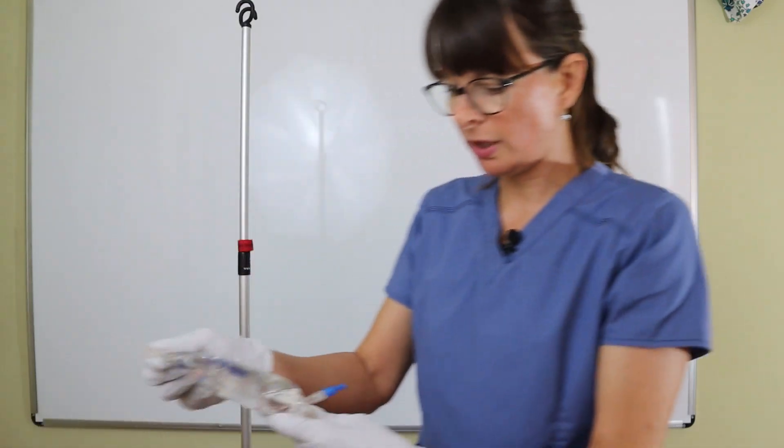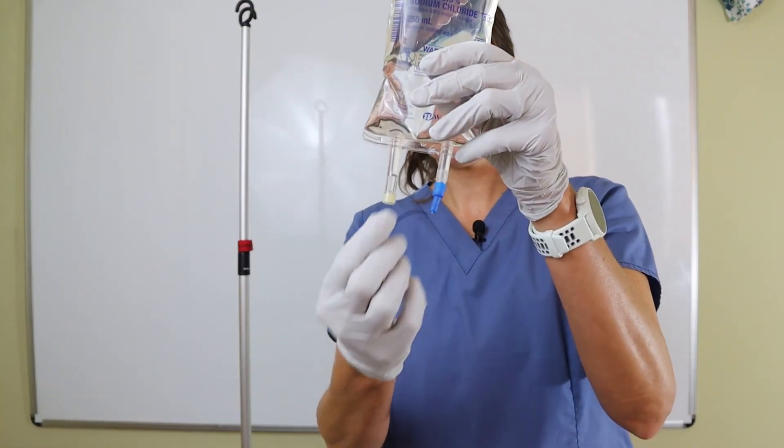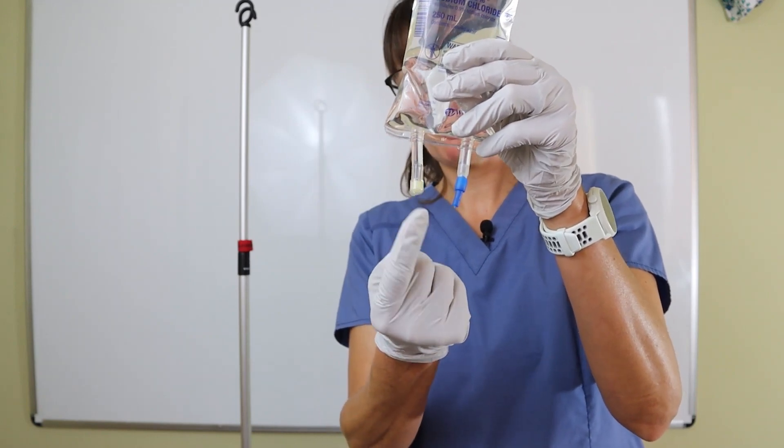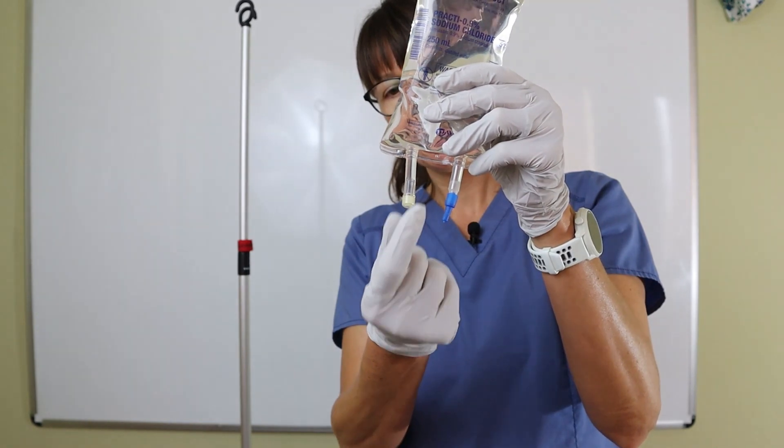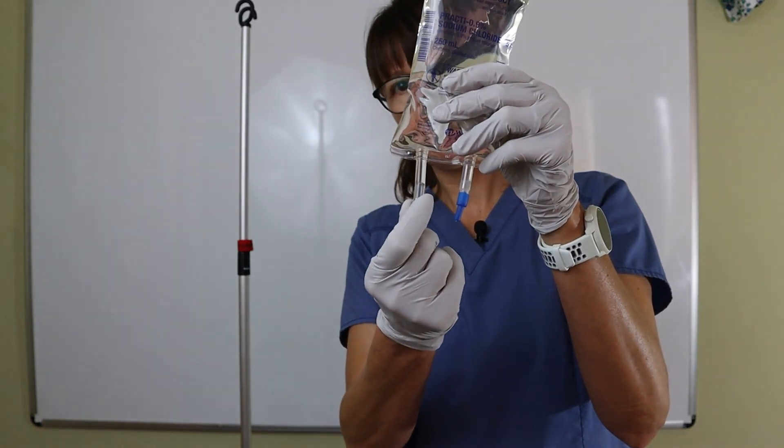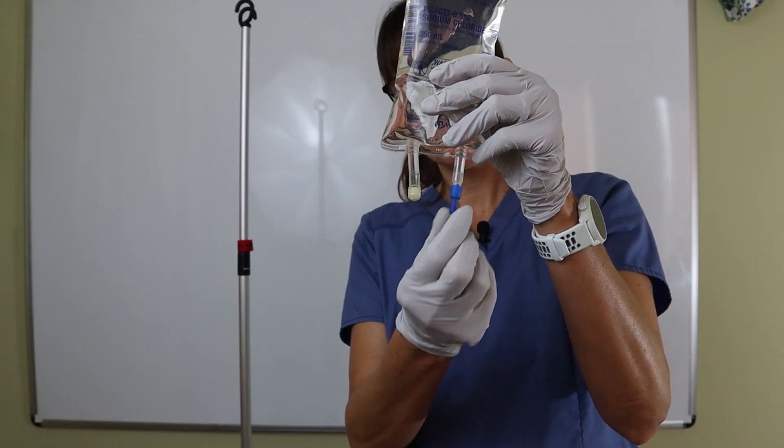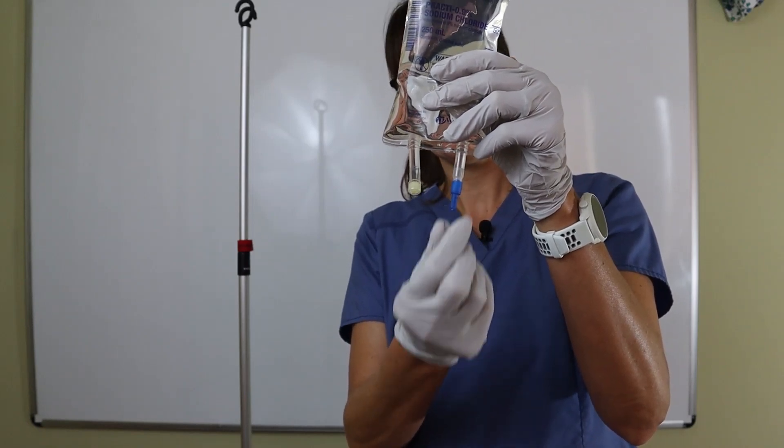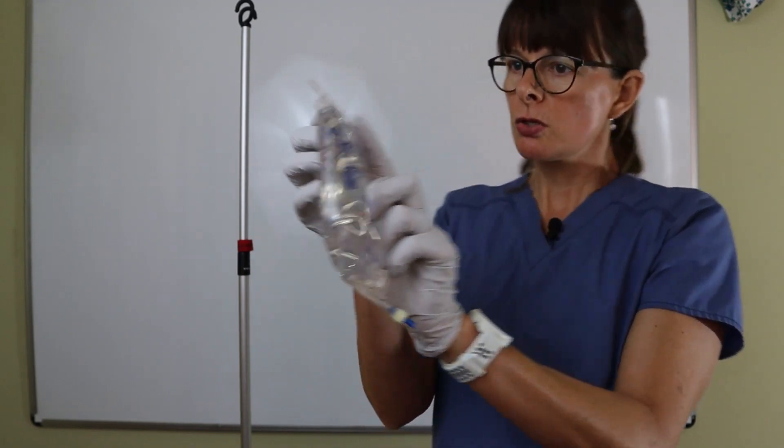The easiest way to do this is to unhook it and look at the different ports. This one with the rubber port allows you to add medication, which we're not going to do for primary IV lines. This little blue stopper—think blue is fluid—is where we're going to hook up our primary IV tubing.